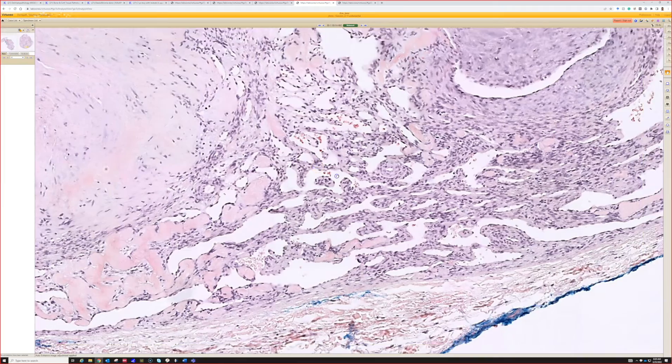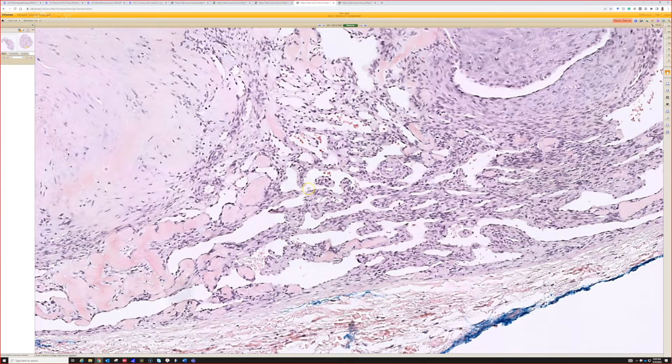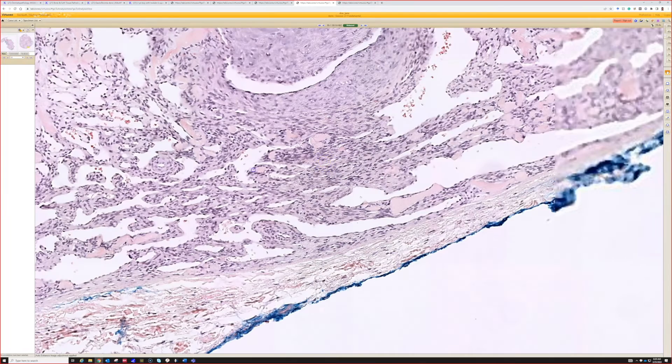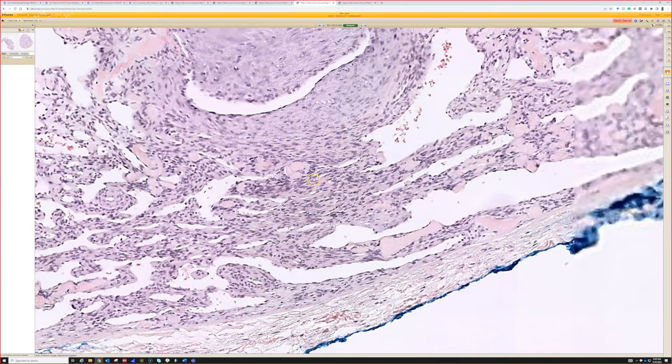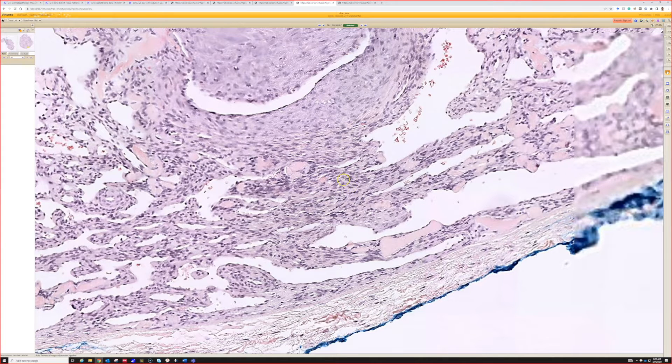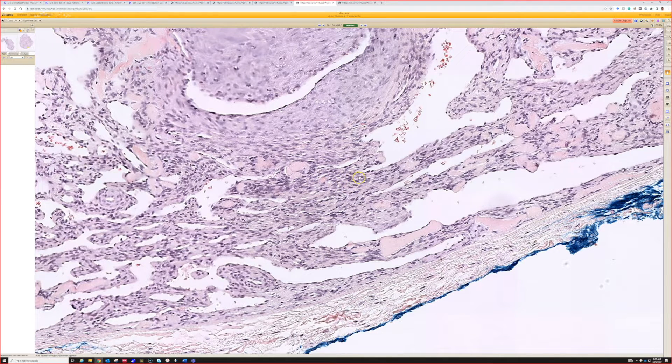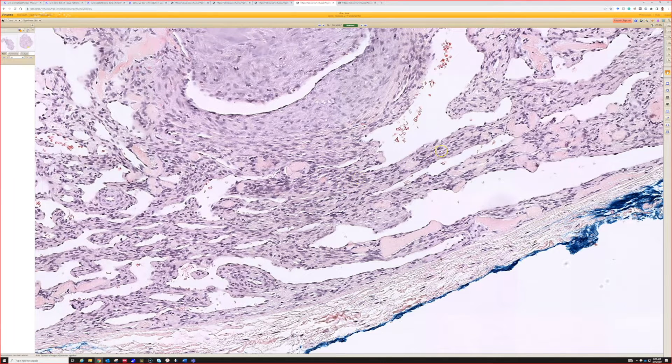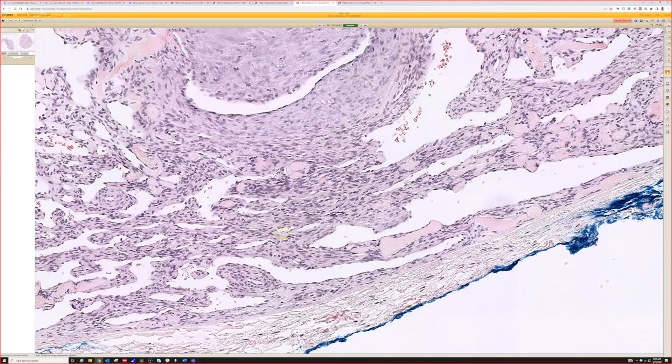They're kind of nondescript cells, slightly plump spindle to oval cells, and they do look here like they're arranging in a little bit of fascicles.